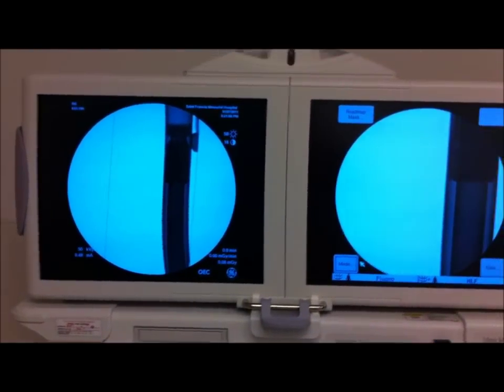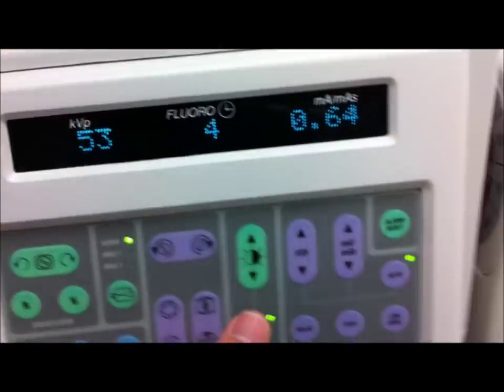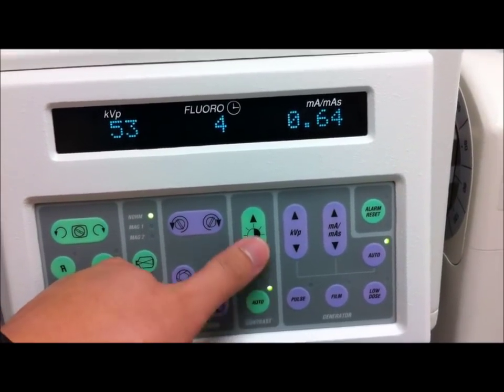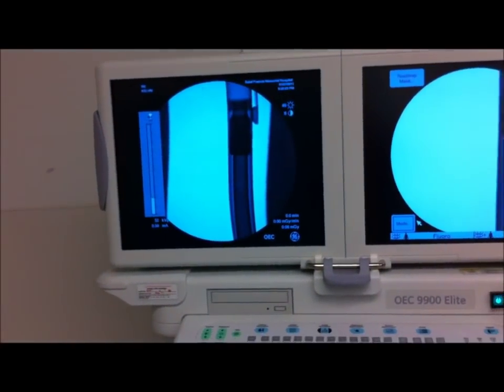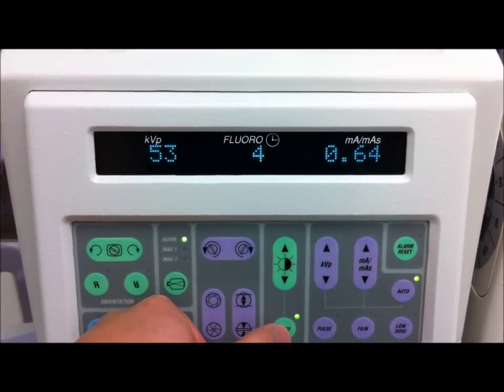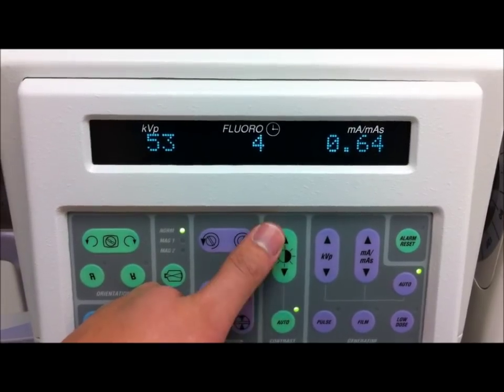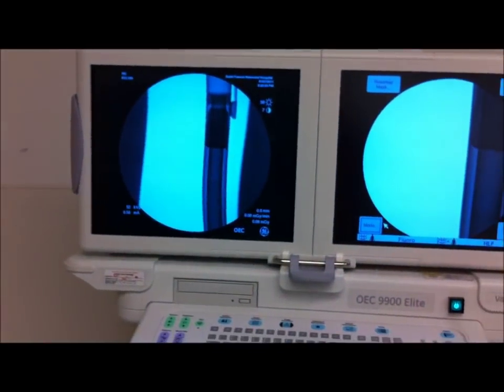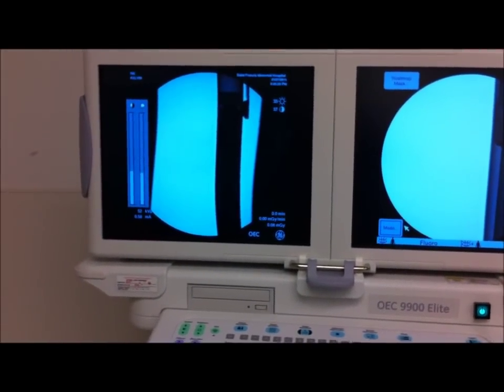Let's fire that and take a look. Moving along — you have your contrast control here. If you press this right now, it'll make minute adjustments — very slight. This only alters what the computer thinks in automatic mode; that's why it's blinking right now, because I've manually attempted to shift it. Pressing auto again turns it off. Now you have a control that will either raise the contrast or raise the brightness — it does it in a logical step so we don't get too much brightness and too much contrast at the same time.